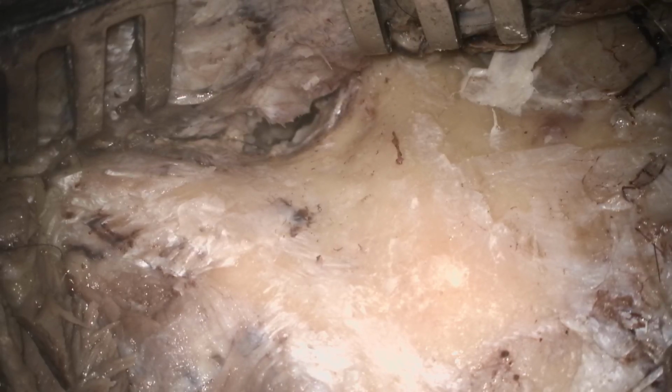For any temporal bone dissection or any type of mastoid surgery, the first thing is the cortical mastoidectomy. Because this is the entry to the mastoid or the cortex of the mastoid bone, and from that part you may enter into the lateral skull base, you may enter into the middle ear cavity even without opening the tympanic membrane.